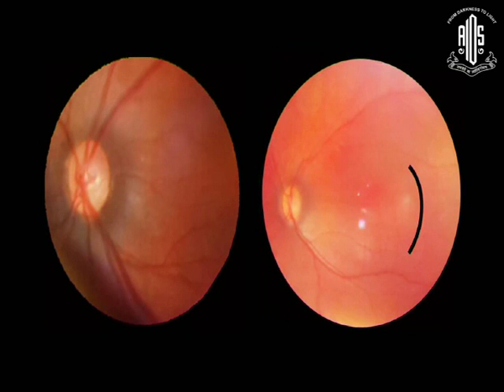We are also trying to bring out a non-contact screening tool for ROP with a wide-angle system. If you look at it, this is a picture taken with the 20 diopter lens, and this is a picture taken with the wide-angle system optics we are using now. And if you look at it, this line represents the end of zone 1. So it is going somewhere a quarter or halfway through zone 2. But we need to improve the field to make it more acceptable.